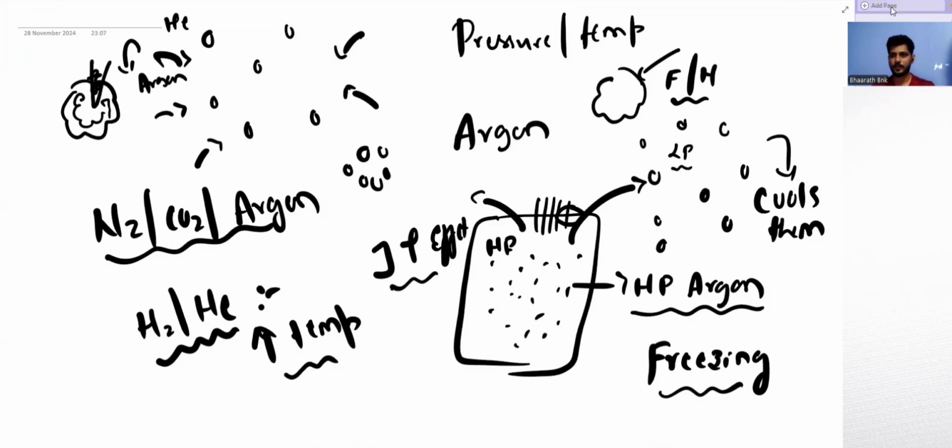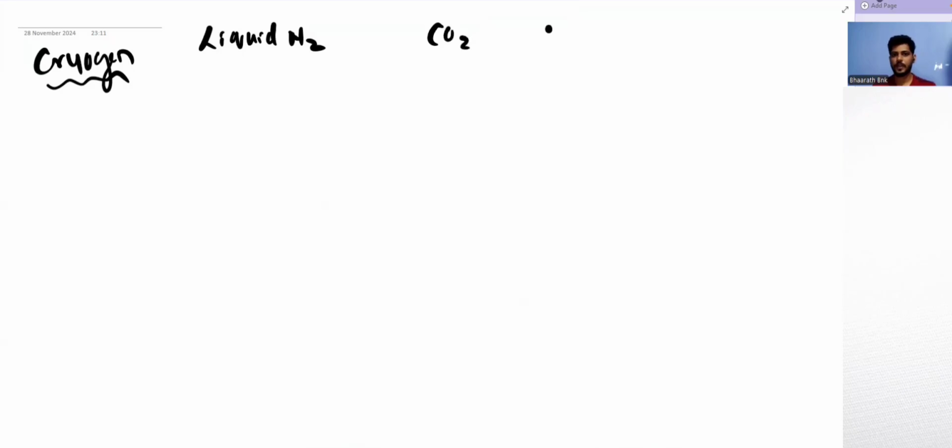Right. So, what are the cryogens that are used? The substance which can freeze is called a cryogen. So, liquid nitrogen can be used, carbon dioxide can be used, argon can be used, or freeze sprays are available. Any of these can be used.